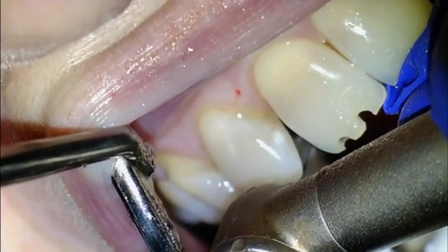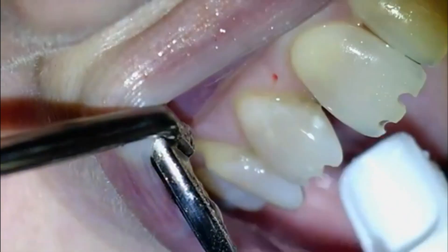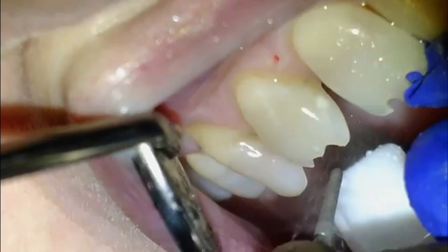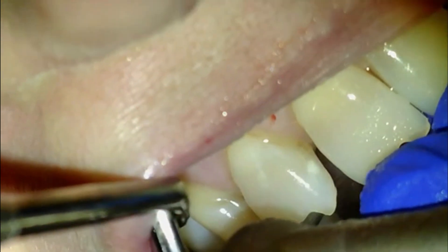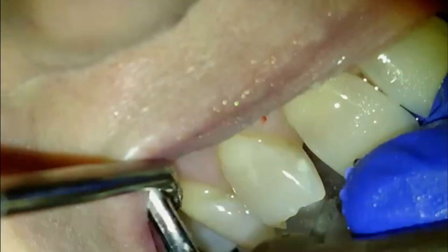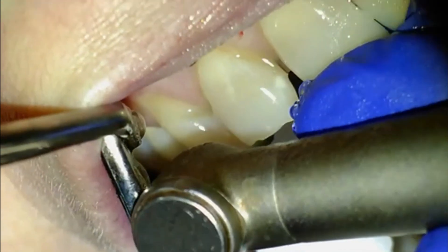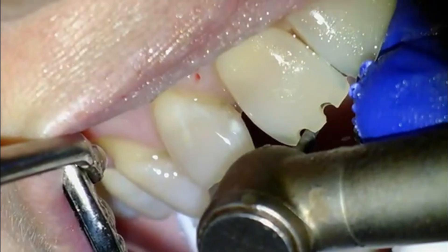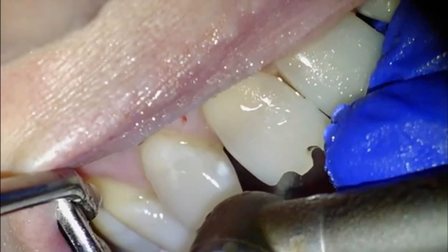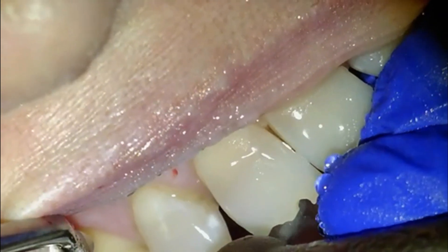The reason it's so difficult is that we need to remove enough structure off of the tooth to then replace that structure with crown material. In this case, we will be using a zirconia crown. Now, those of you familiar with zirconia and patients that have a lot of wear and attrition may be thinking that zirconia will completely demolish the lower teeth as she grinds against them, because zirconia is extremely hard compared to tooth structure. This is true.